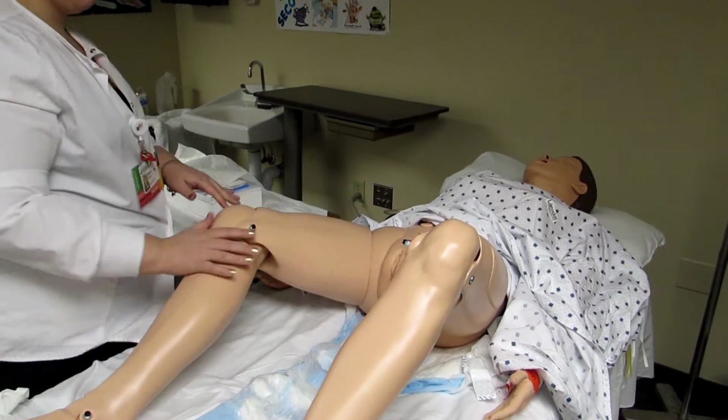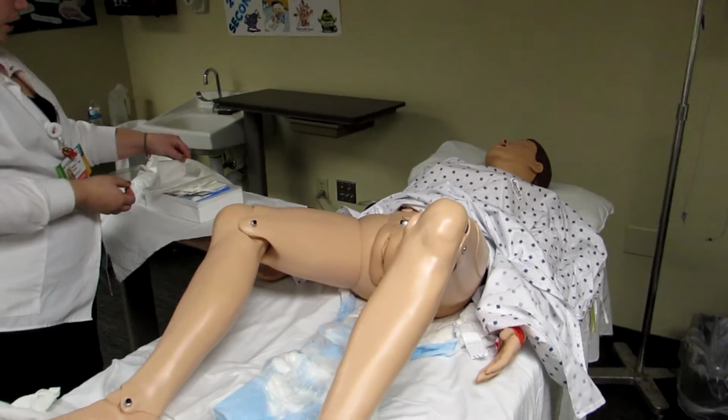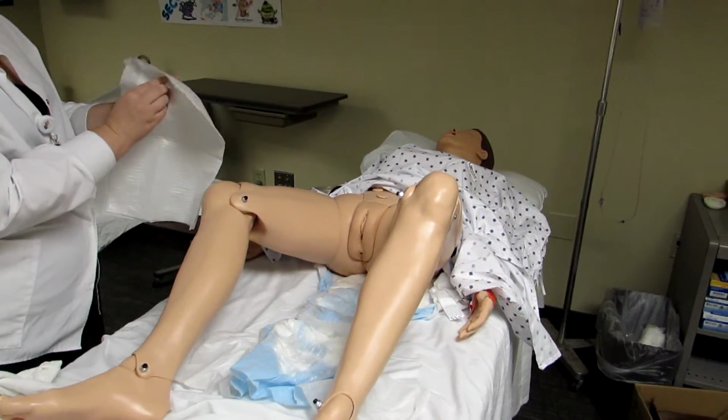Like I said, I already performed my perineal care. So now I have this first drape that I showed you in the last video. I'm going to grab it by the shiny side, because that's the side that's going to go down.